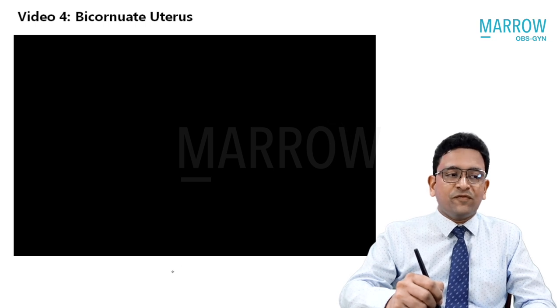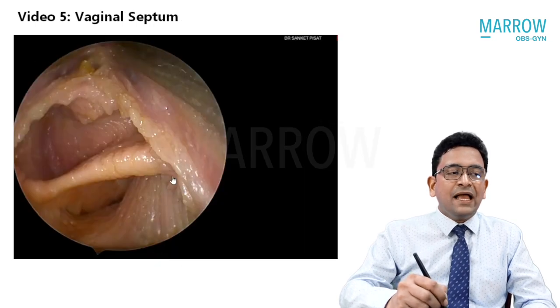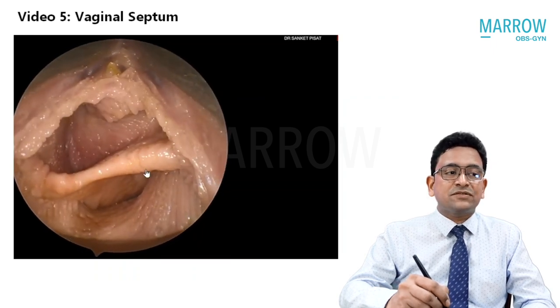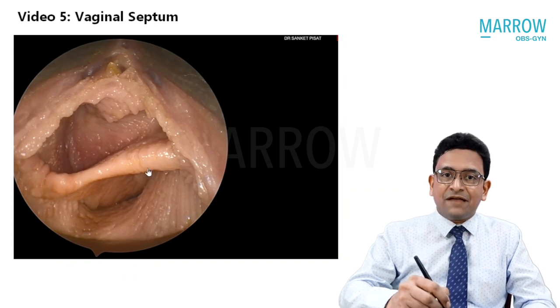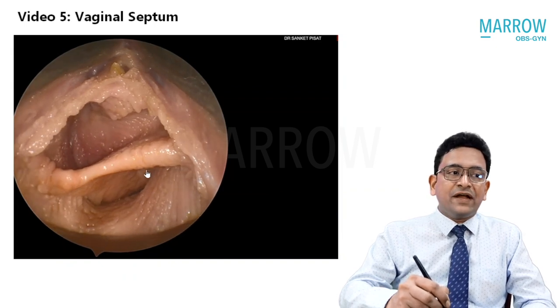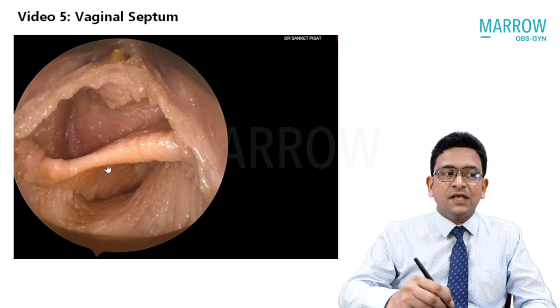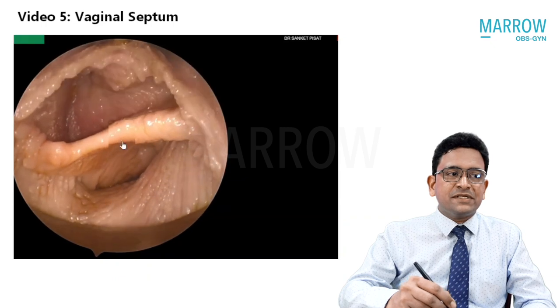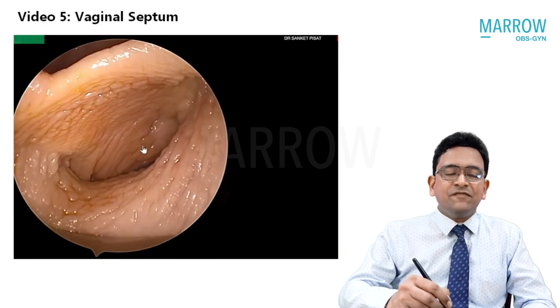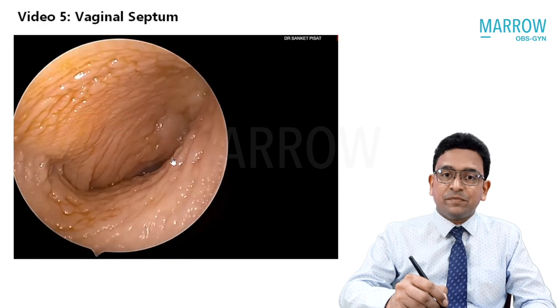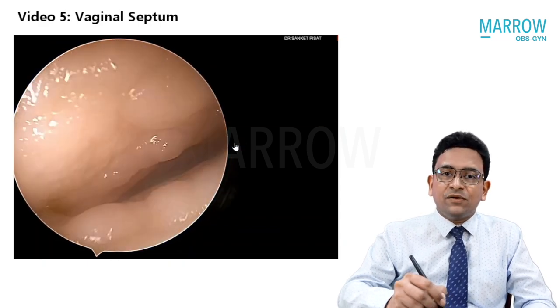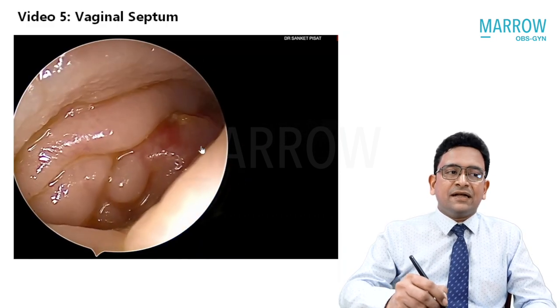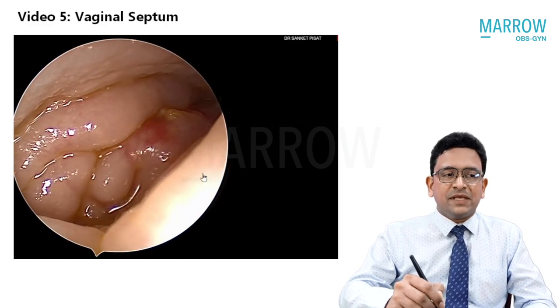Now, this is a video of a vaginal septum, which means the septum has not limited itself to the uterine cavity but is also dividing the vagina into two halves. This lady has an oblique vaginal septum, but many times it is a vertical septum. When the scope goes inside, you will see the same picture — this is a complete non-fusion of both the ducts, and she practically has two separate uteri divided by a vaginal septum in the center.